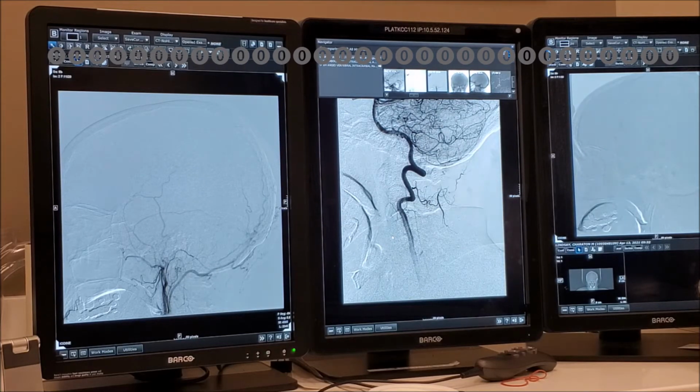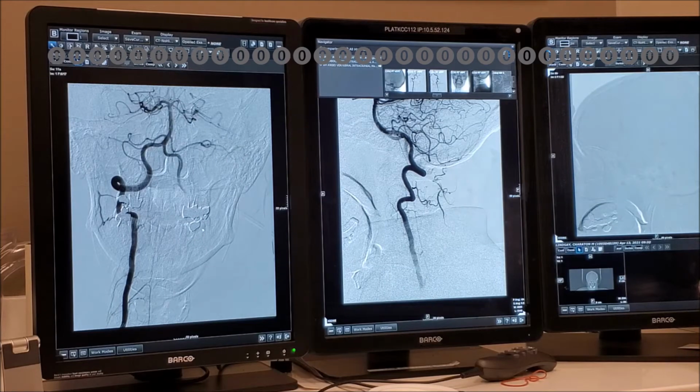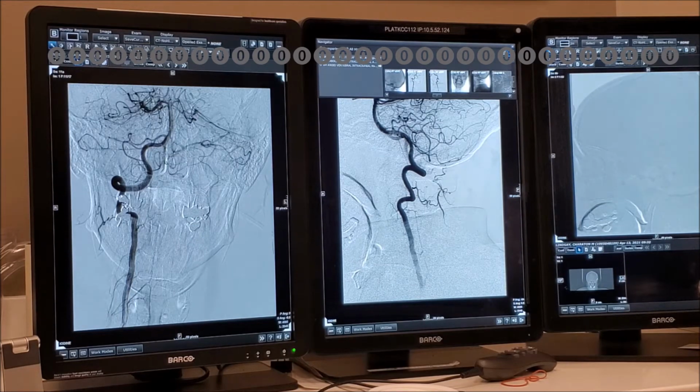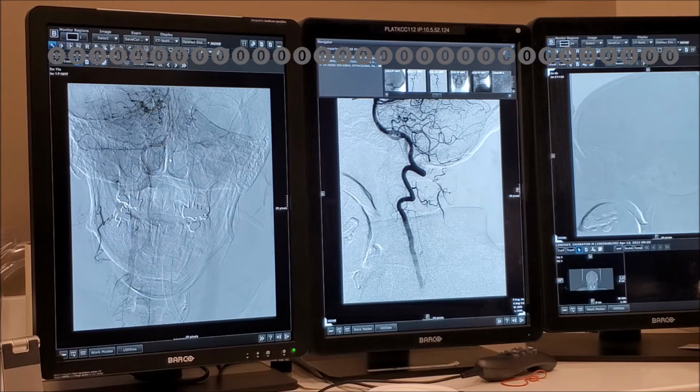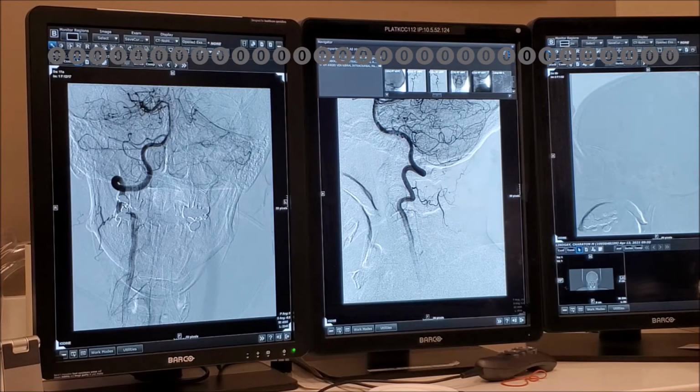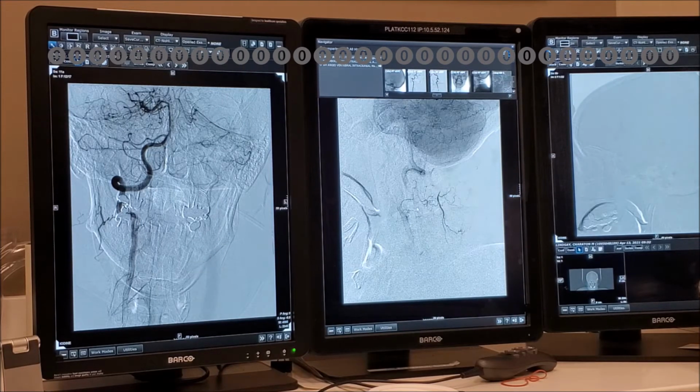Okay. Good. Look how nice the anterior spinal artery is. So now we need to see if we can do this. Okay, where were we? Yeah, this is the AP for that. There's too much motion here. We can't see it, but definitely there is. You see it here, right? Those two will anastomose, will connect.